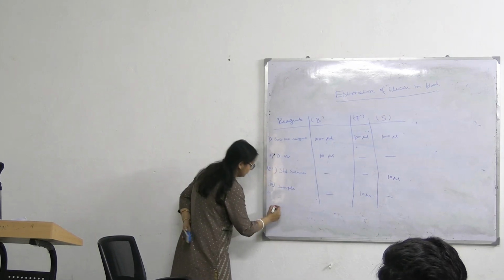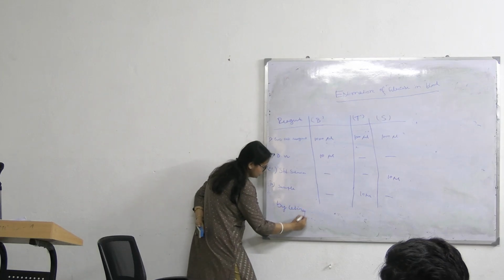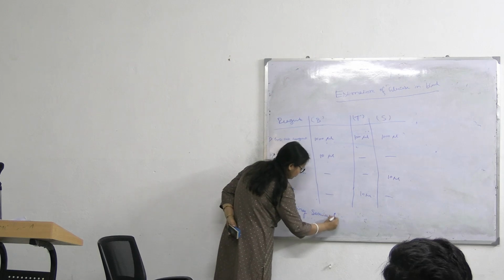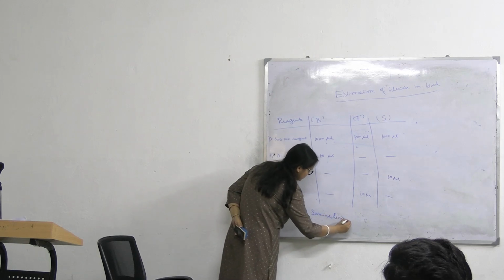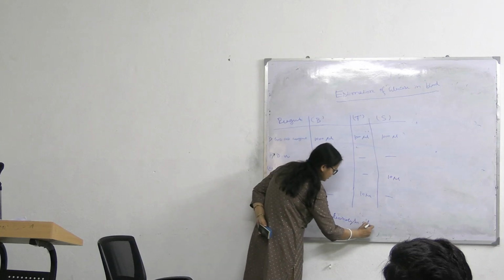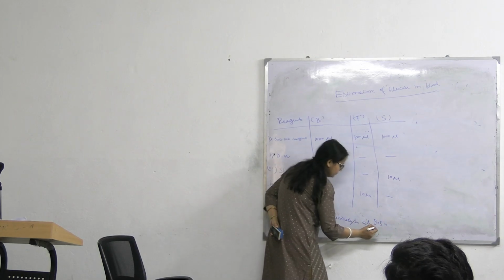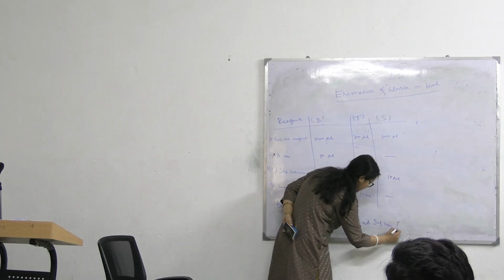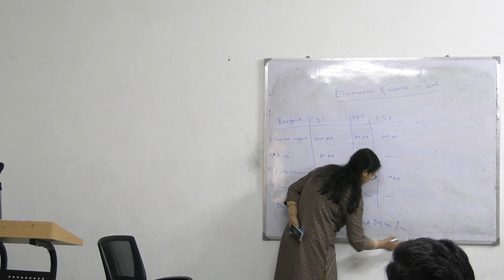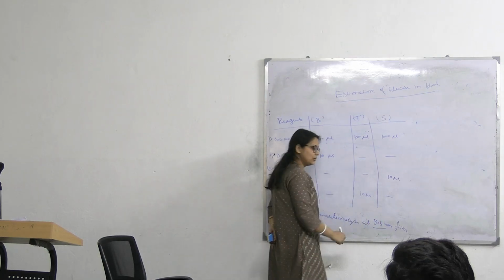Okay, and after that you have to, acha, eta to holo mixture absorbance, তারপরে অ্যাড কর by using semi auto analyzer at 505 nanometer filter, that is এটা কোন কালার রেঞ্জে পড়ে বলতে পারবি কেউ?